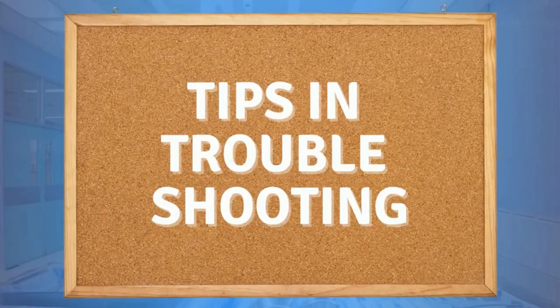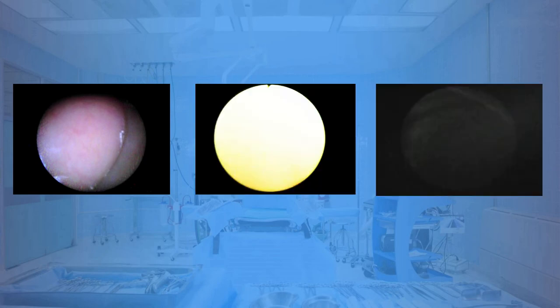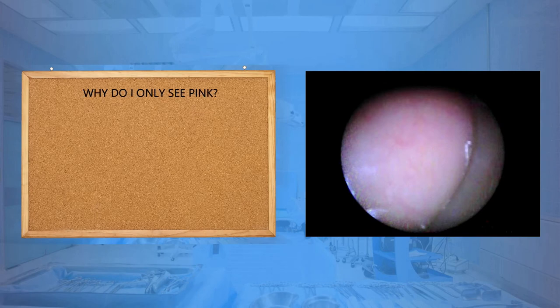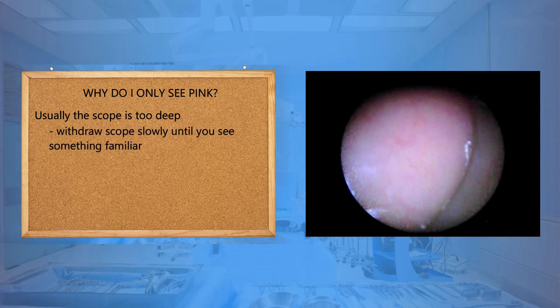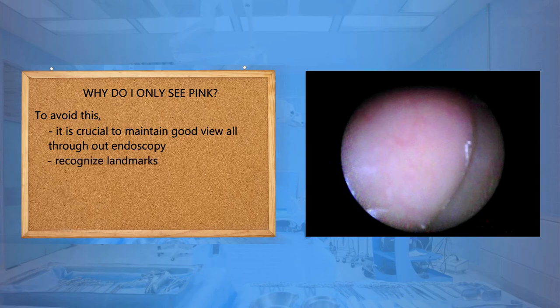Some tips in troubleshooting. There are times when you only see pink, sometimes only white, and sometimes black. Why do you only see pink? Usually the scope is too deep — withdraw the scope slowly until you see something familiar, then follow the darker area. To avoid this, it is crucial to maintain a good view all throughout endoscopy. You must recognize landmarks and use slow and subtle movements.